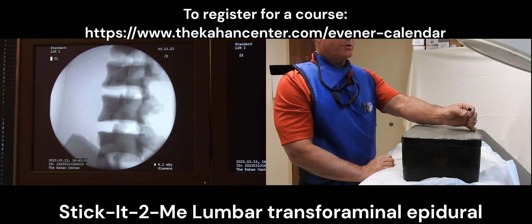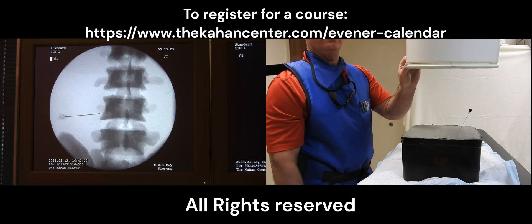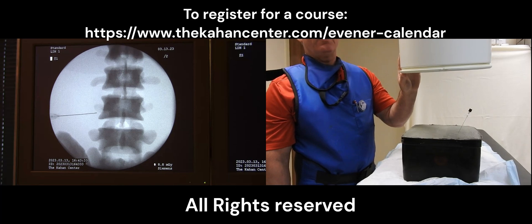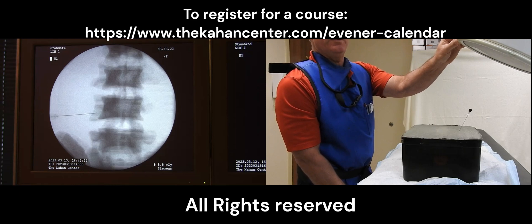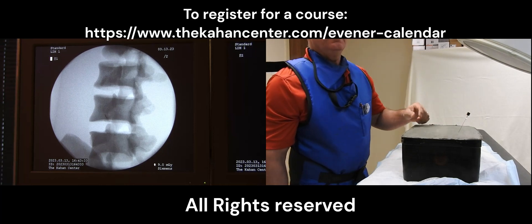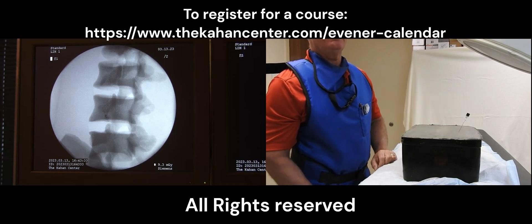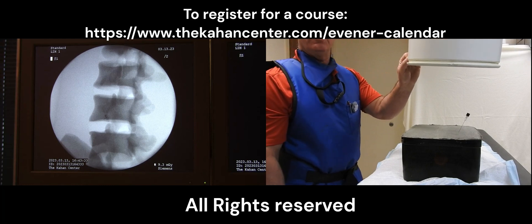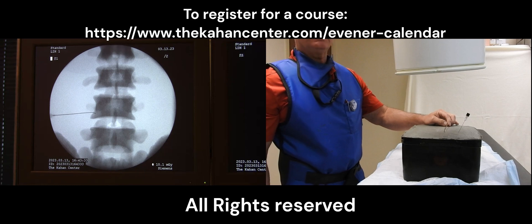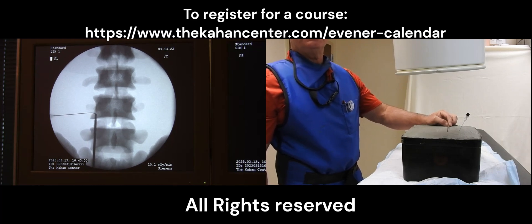At this current time I'm in good position. We will straighten it out so it's just underneath the neuroforamen and I will check my depth by going to an AP view. As you can see, I am heading underneath the transverse process but I am still outside the neuroforamen. We have good alignment and we're going to continue on that trajectory into the transforaminal epidural space. Going back to our oblique view, I will gradually rotate things back and forth to go deeper. Once I feel comfortable that I'm getting closer to the transforaminal epidural space, I continue to check my progress by going to an AP view. When entering the transforaminal space, we want to make sure we're between the six o'clock position of the pedicle and the nine o'clock position of the pedicle. At this current time I would say this is about eight o'clock.